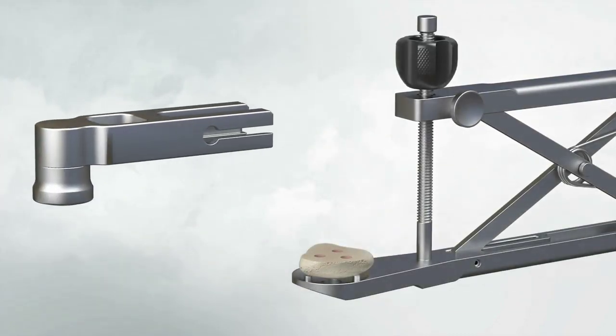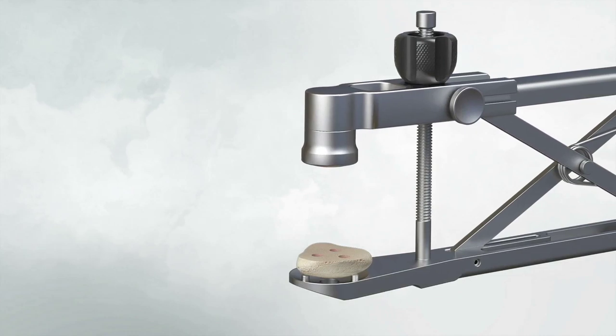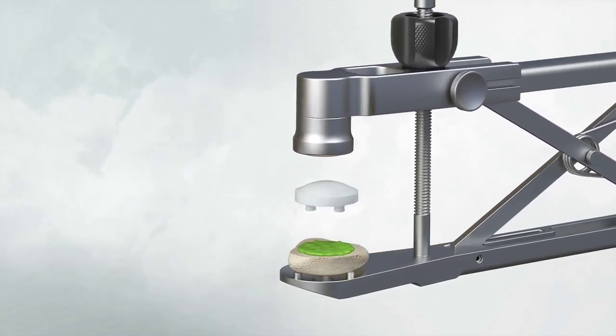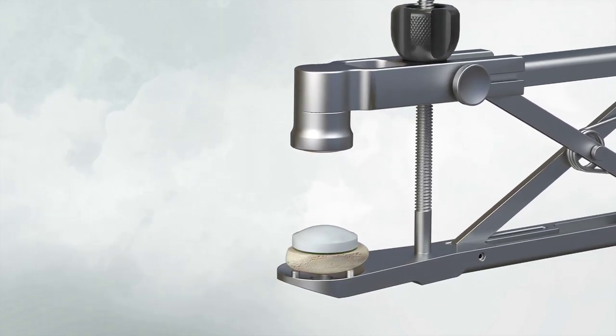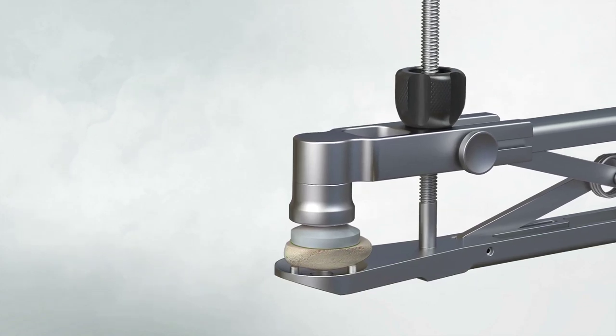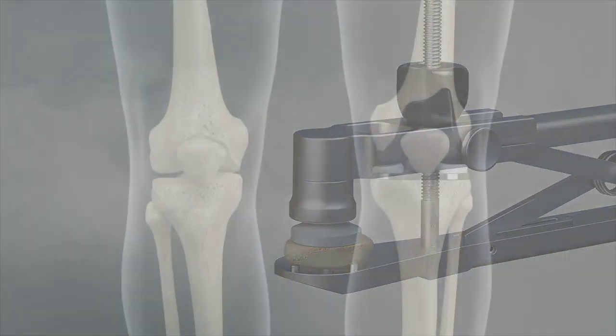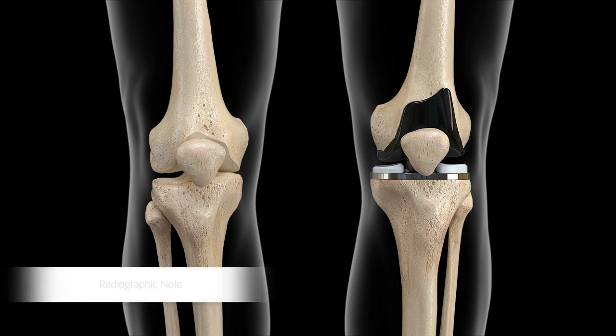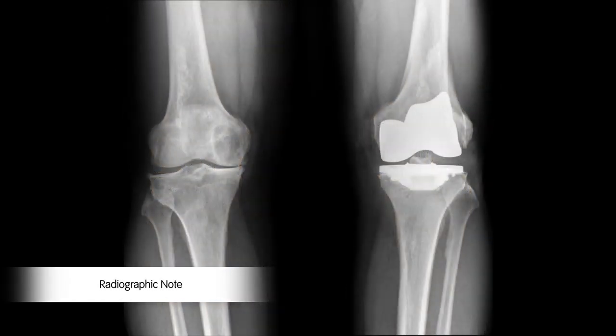Assemble the patellar cement clamp to the patellar reamer guide. Apply bone cement to the reamed patella. Place the patellar implant onto the prepared patella. Clamp the patellar implant into the bone and remove the extruded cement. Close the arthrotomy by placing three Vicryl sutures at the superior border of the patella just distal to the VMO. A stitch is placed to close the VMO fascia. The remainder of the arthrotomy is closed in the standard fashion. Perform routine subcutaneous and skin closure.